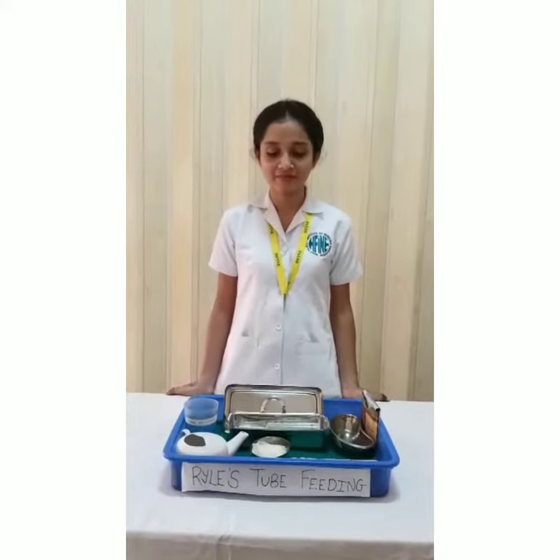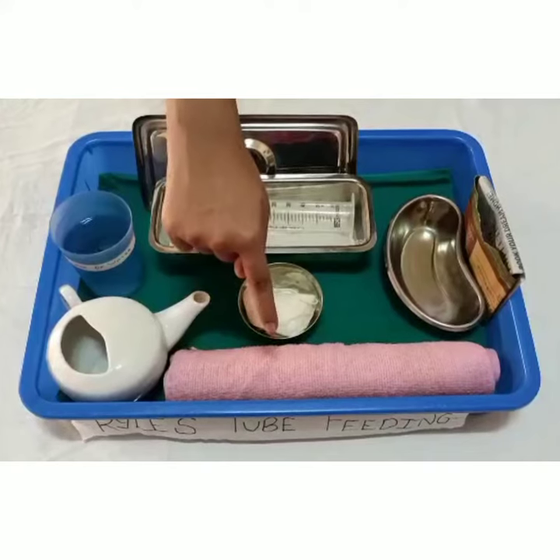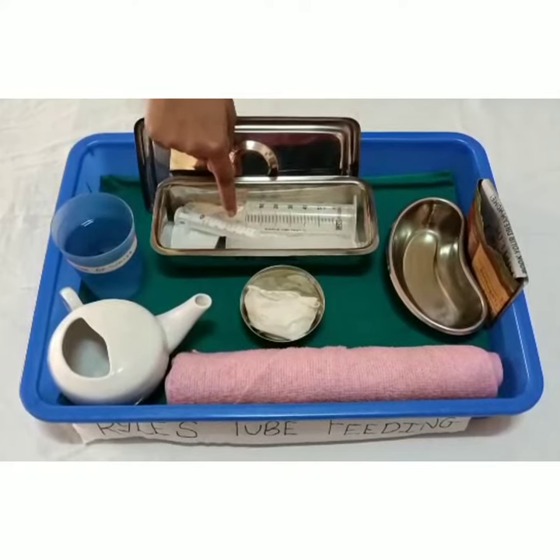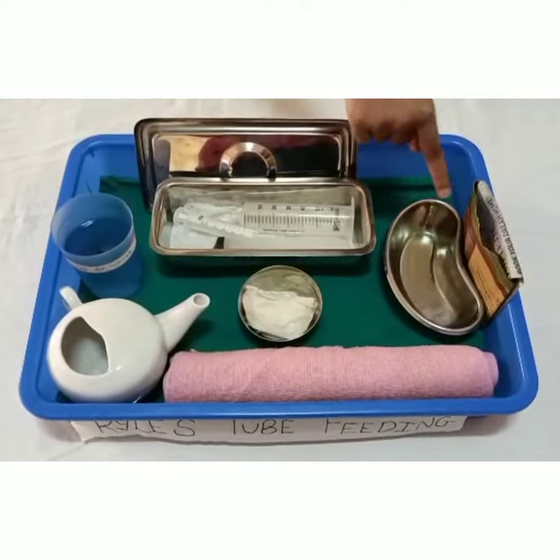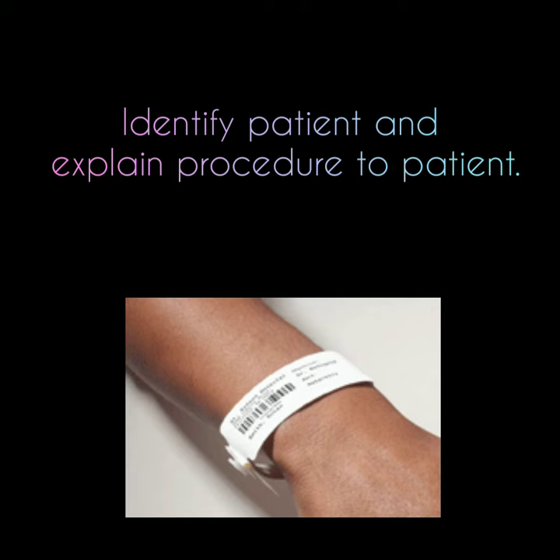Articles: A clean tray containing Macintosh with towel, clean gloves, large syringe, 10cc syringe, formula feed, water in a container, kidney tray, and paper bag.